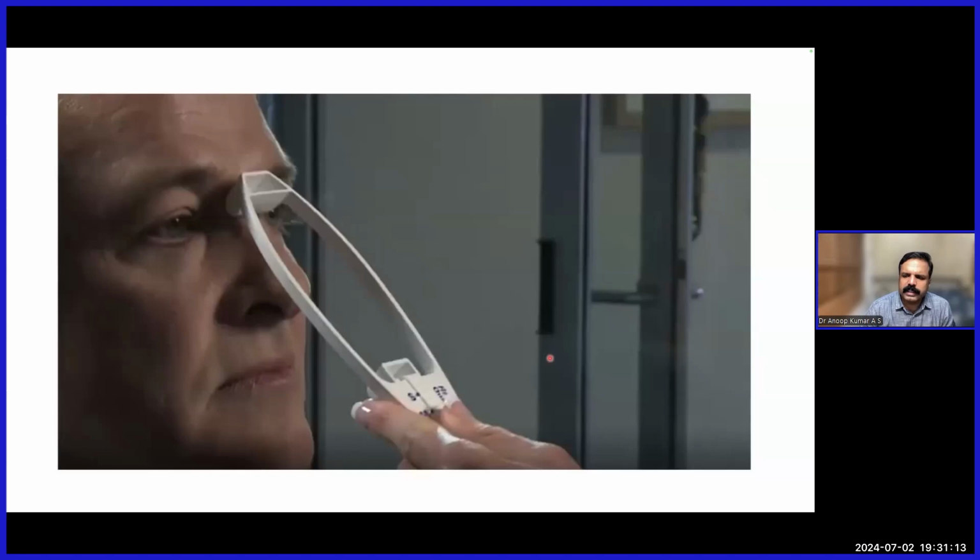And once you have decided on an oronasal mask, how will you decide the facial mask size? There is a caliper like this. The first part of the caliper should be kept in the nasal cleft here. Then the second should be kept on the chin here.